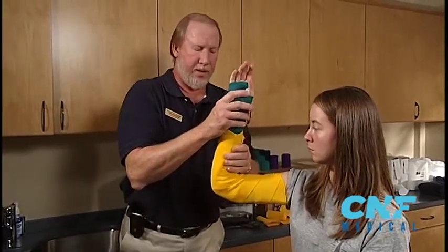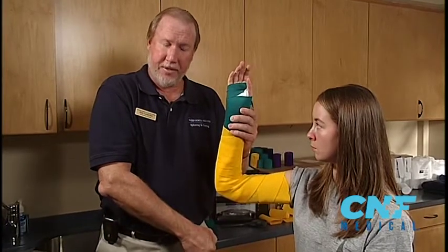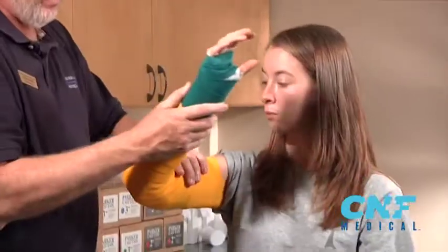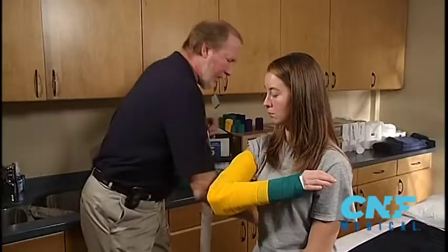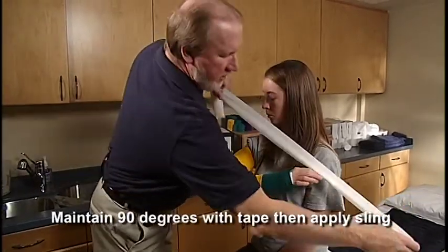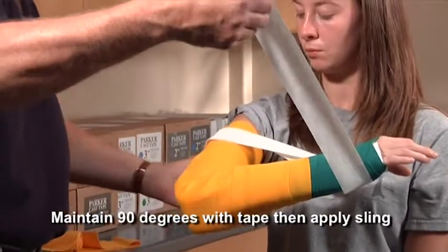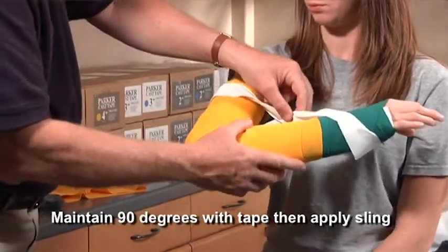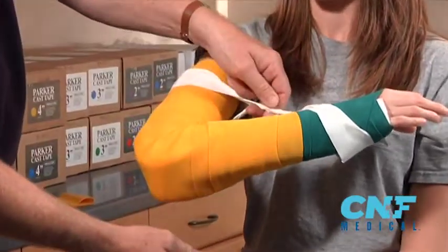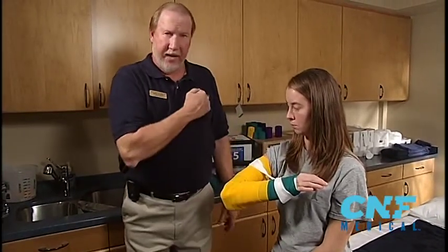Now what tends to happen with posterior elbows: as soon as you put them in a sling, they tend to relax and fall to 45 degrees. To prevent that from happening, place the patient's arm across their chest and take some tape. Place it right at the patient's wrist of the splint — the inside one goes on the outside of the splint, this goes on the inside, just a figure eight. Then at the top of the splint, twist it in the middle — a little turnbuckle effect — and watch the patient's elbow come up above 90. So now when you put the patient into an arm sling, they can relax and the patient stops at 90. Bring the sling to the patient, not the patient to the sling.